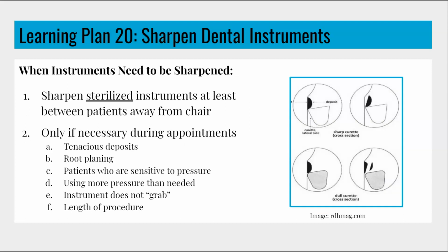Only sterilized instruments should be sharpened for the safety of the clinician to avoid accidental injury during sharpening of a non-sterile instrument. However, there may be times when it is necessary to sharpen an instrument during an appointment. Use extreme caution when sharpening non-sterile instruments.